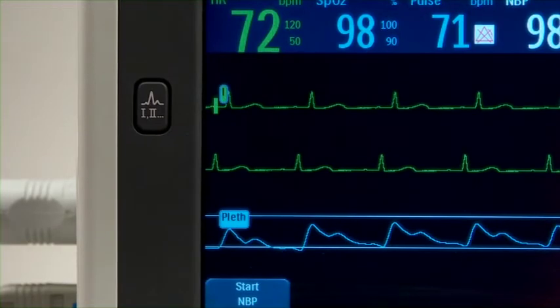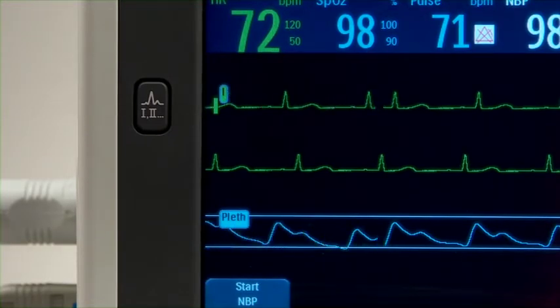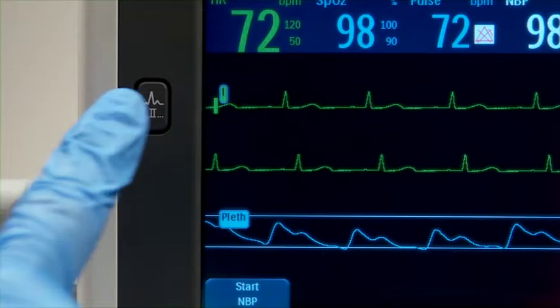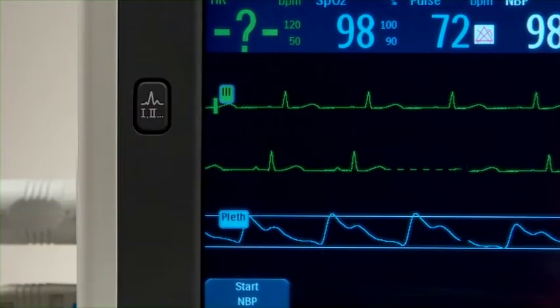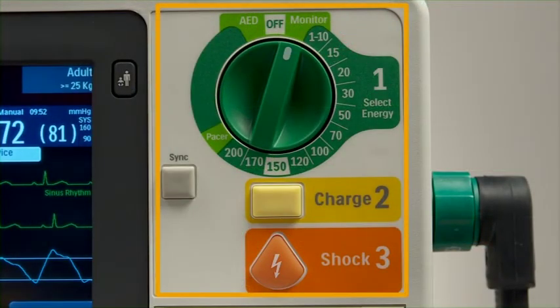The Lead Select button changes the ECG lead in wave sector 1, cycling through the available ECG waves and changing the displayed wave and its label. These controls are used for automated or manual defibrillation and synchronized cardioversion.